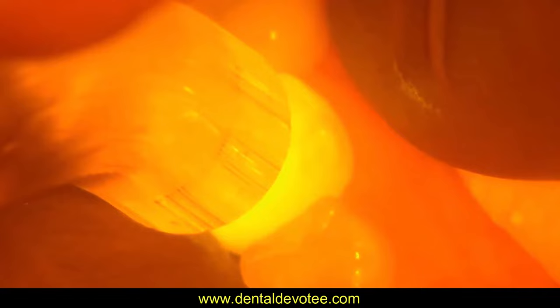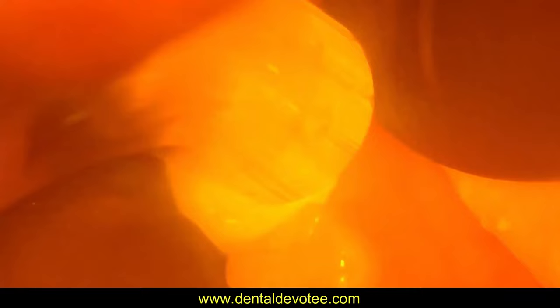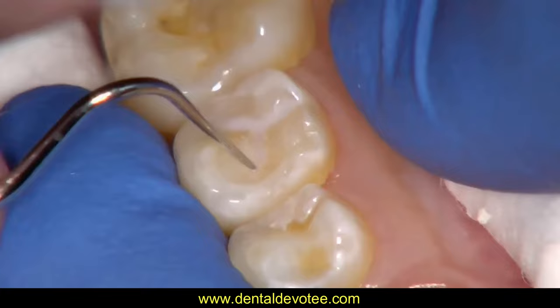Deposit pit and fissure sealant resin covering all the pits and fissures in a very thin layer. A small excavator or periodontal probe are useful to spread over the pit and fissure and remove any air bubbles if formed. Light cure for 15 seconds.